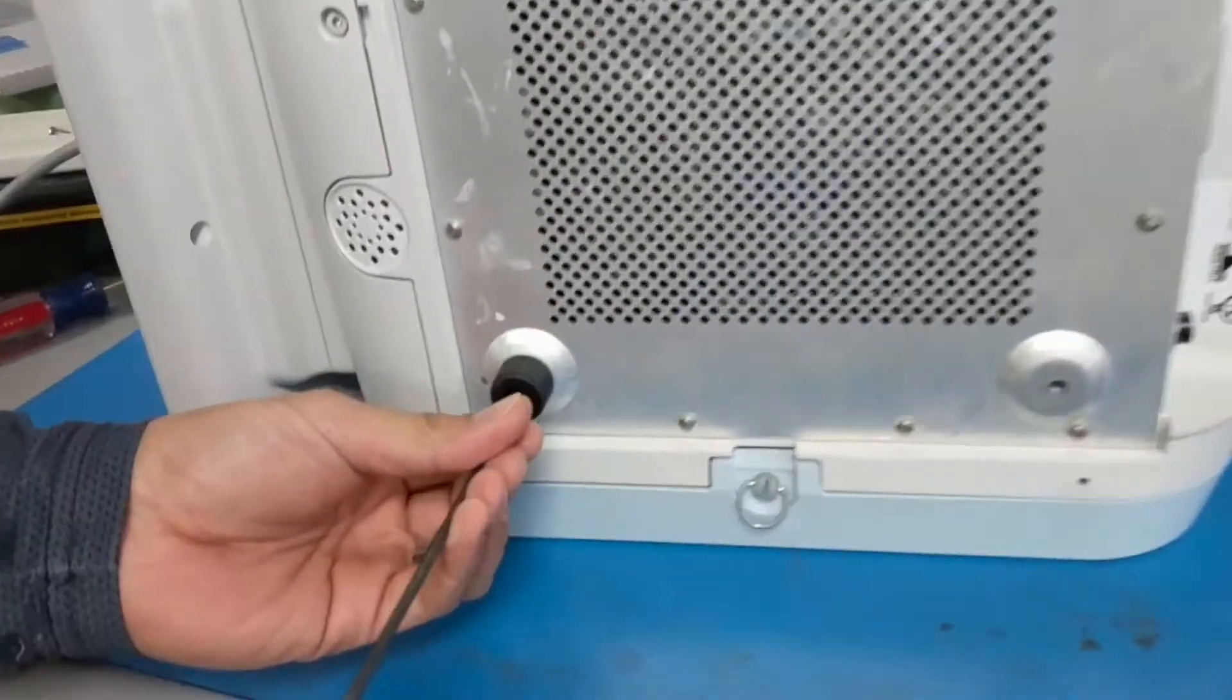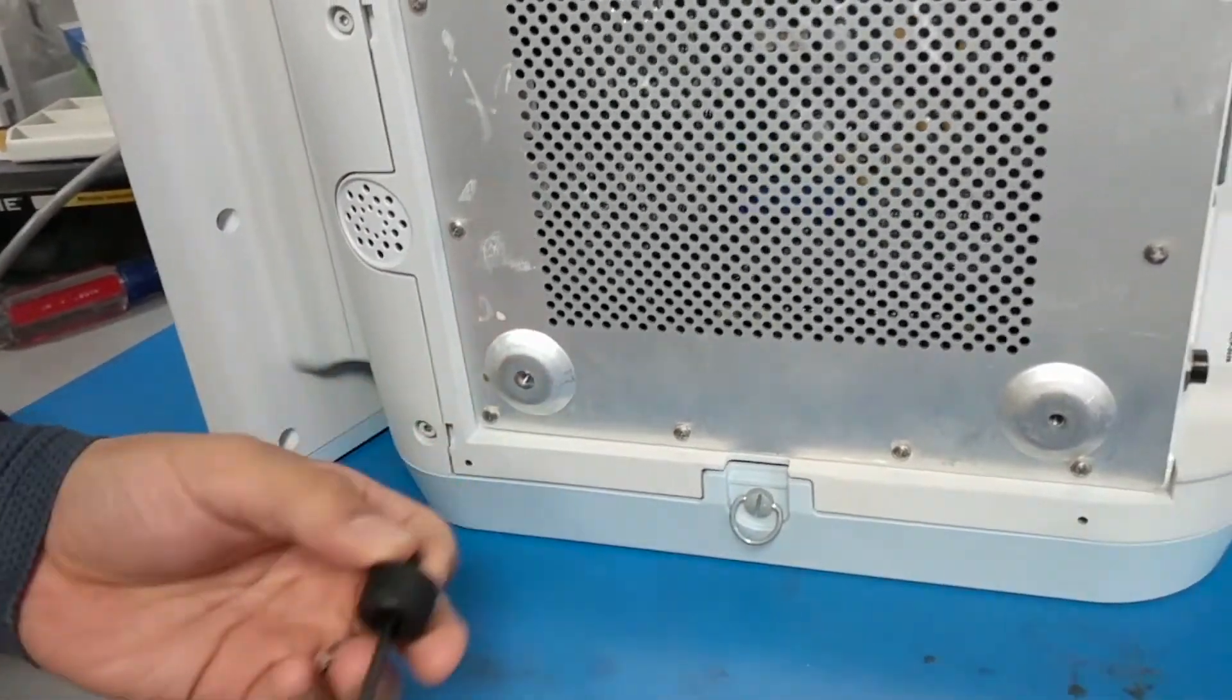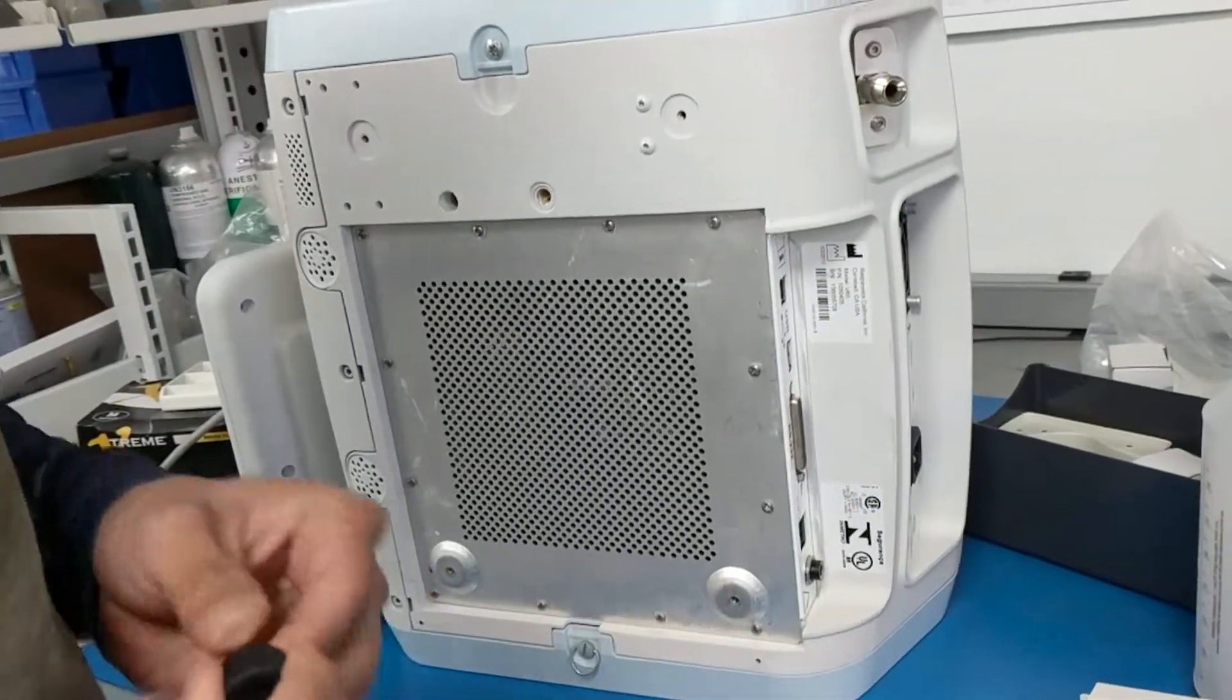These bottom two feet, the screws that go into these bottom two feet, you will use. You have to remove them, squeeze them out.